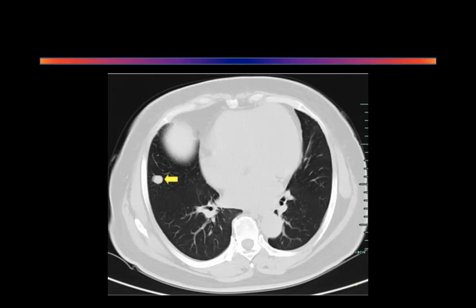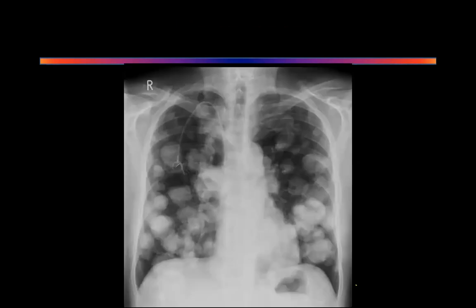But what are the other diagnoses? What looks like this? Can it be a carcinoid, peripheral carcinoid? Possible. Very good. What else can it be? Metastatic nodule. Adenocarcinoma. Yeah, it could be a metastasis, guys. It's a nicely rounded, peripherally placed lesion. Don't forget, this might be metastasis. So I agree with all your diagnoses. The one thing you have forgotten is to say this could be a solitary metastasis. Okay? All right. Next.